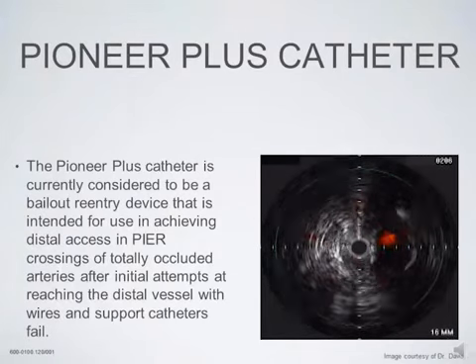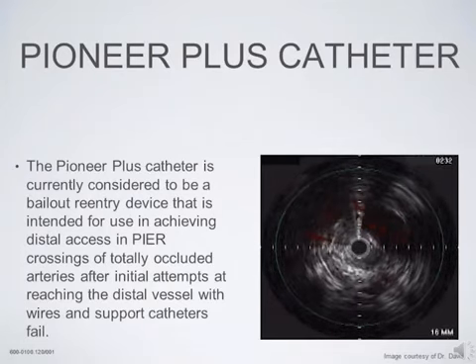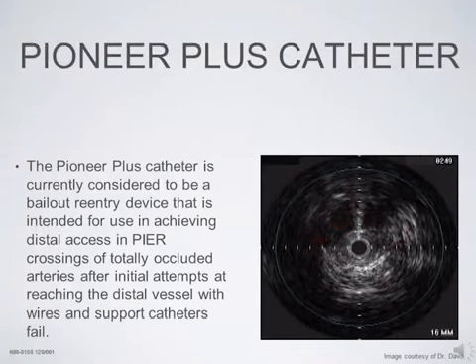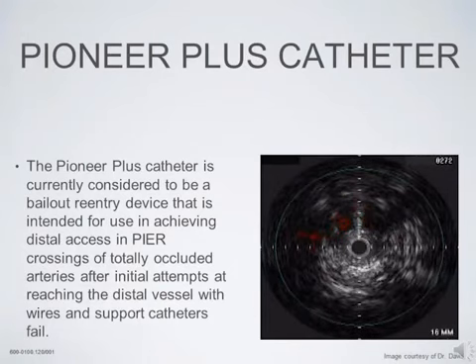This is an example of the movie of a sub-adventitial area. The vessel's rotating, and now it's at 12 o'clock, as you can see. And how we do this is we rotate the catheter till the vessel is in the 12 o'clock position. Then the needle can be punctured into the open vessel, thus re-entering the vessel beyond the point of actual exit point.